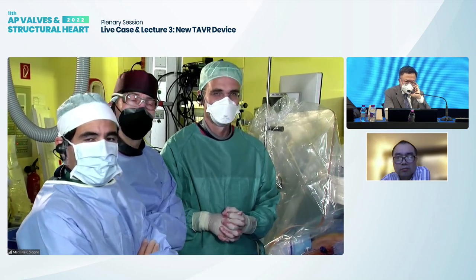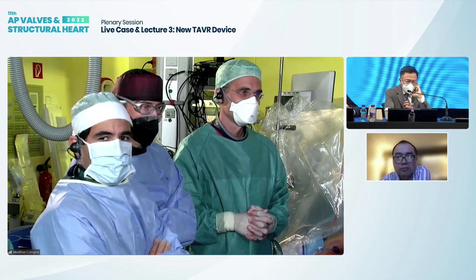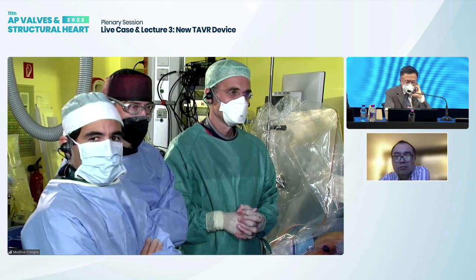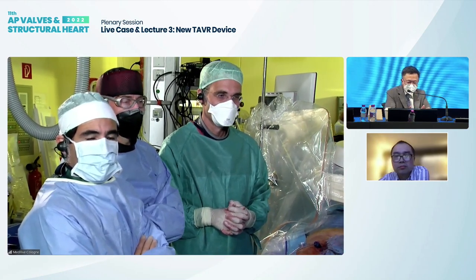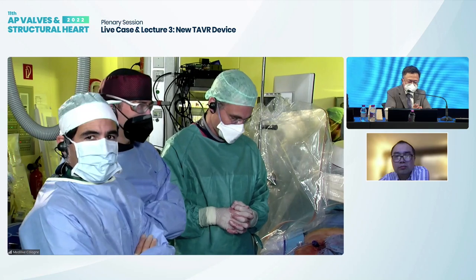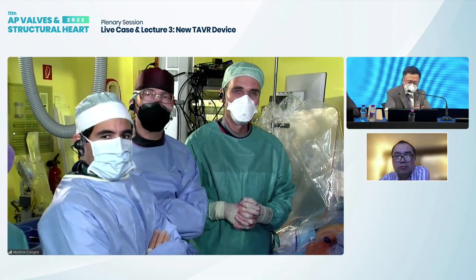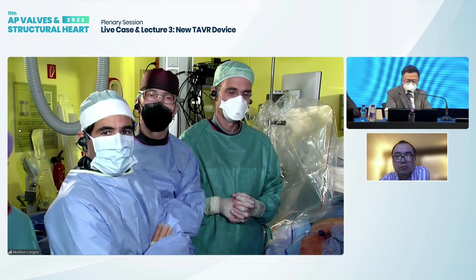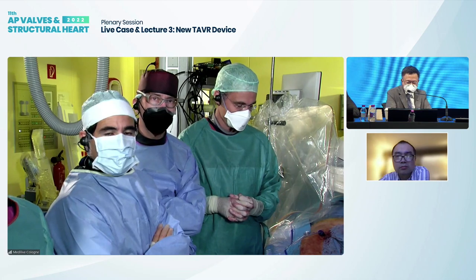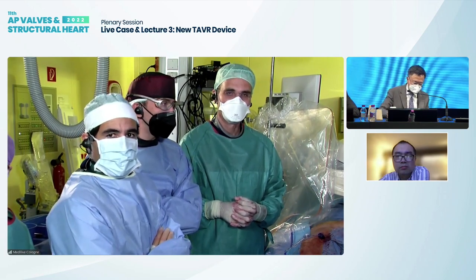But it seems like if you have a thick leaflet, the valve part is actually a little smaller, so it's not touching the wall, versus a very thin leaflet for AI, then essentially there's no space between the two clip, right? The locator and the inside, and therefore the bottom part is a little bit bigger, and maybe touching the wall and therefore causing pacemaker. Right. Exactly.